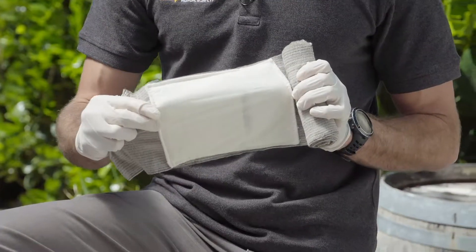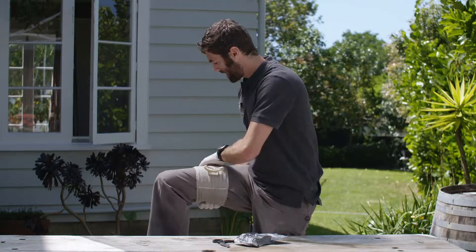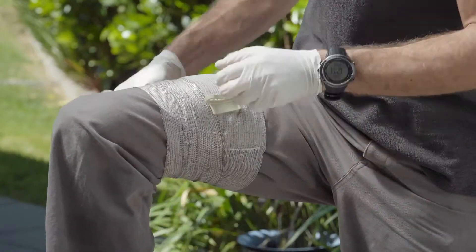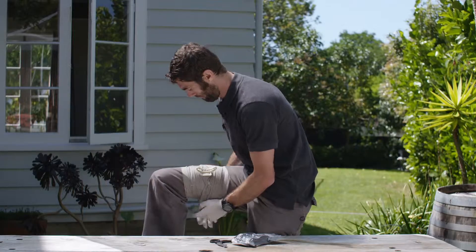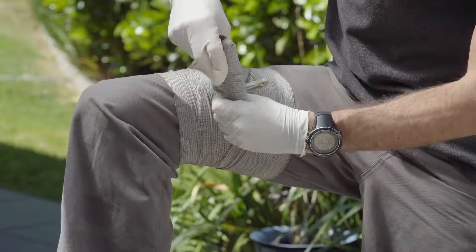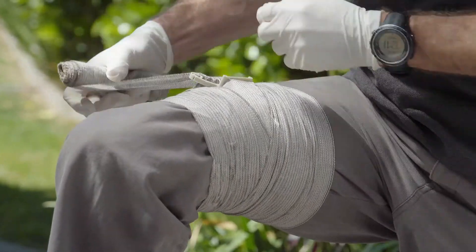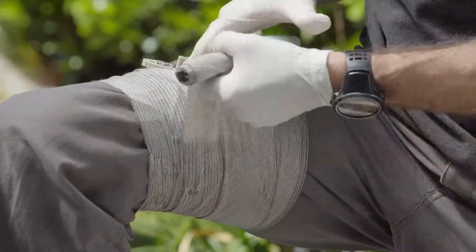There's a dressing on the underside — place that on nice and tightly. We want to first anchor the bandage down by going above and below the torsion bar. We go through the torsion bar, crank it nice and tight, and continue to wrap it up tightly and fully.